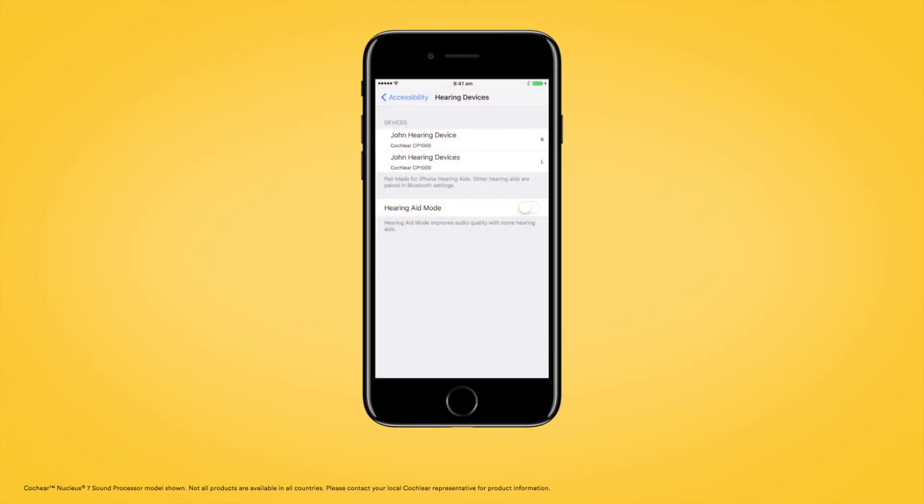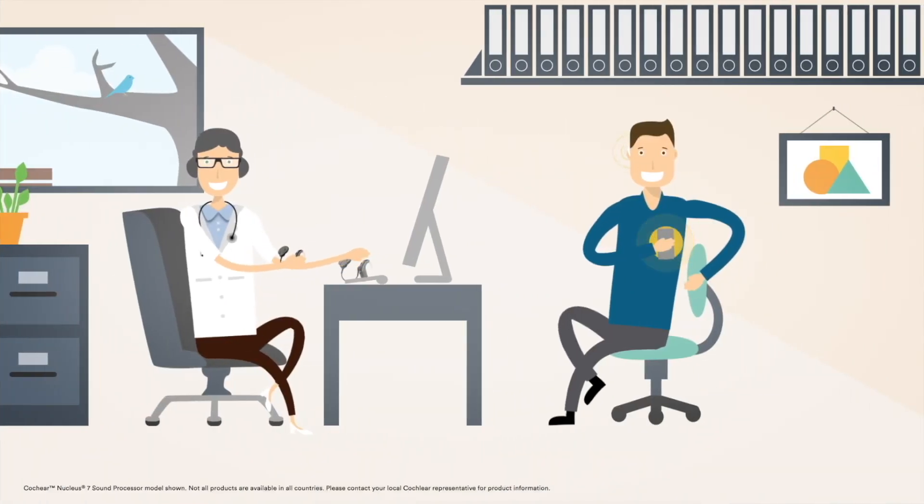If you see your sound processors listed as two separate devices in the Devices section, see your clinician to have them configured as a pair.